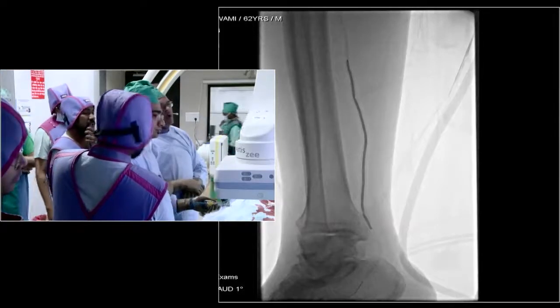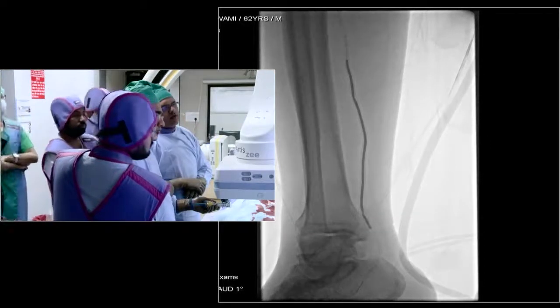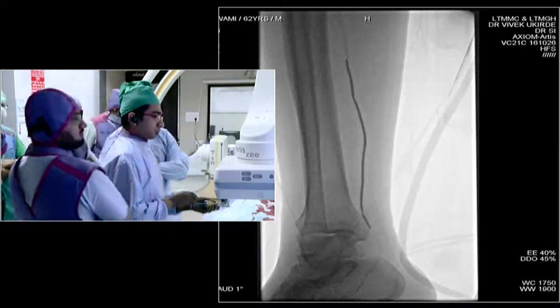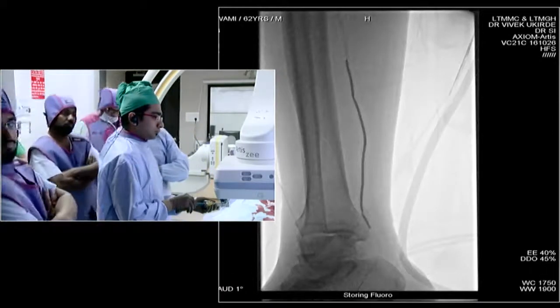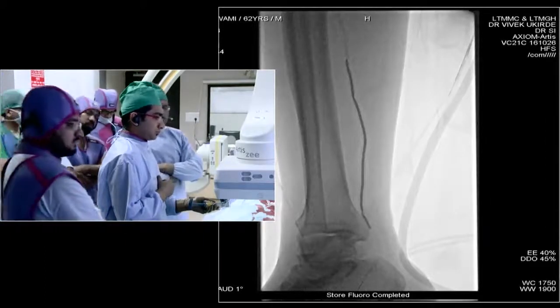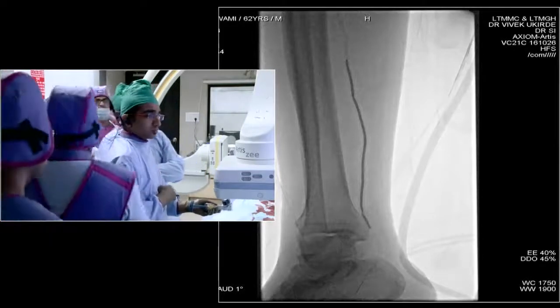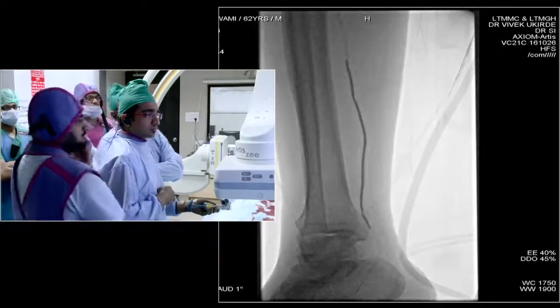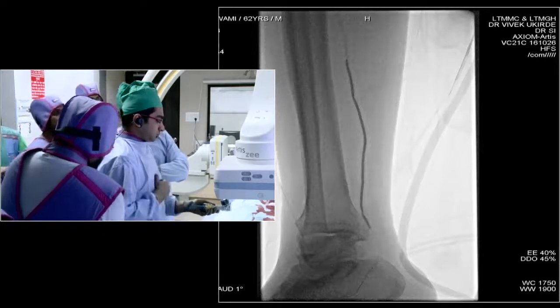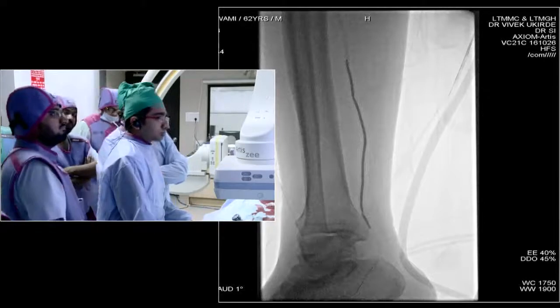If you go more than that, we might rupture the plaque — it's a small size vessel and I don't want that, because a small plaque rupture can further cause a problem in the distal flow. The distal segment is still not open. The idea is to just open the vessel and give adequate flow for the ulcer to heal. I was expecting that after this angioplasty the vessel would become so clear that I may not even see that small segment stenosis.